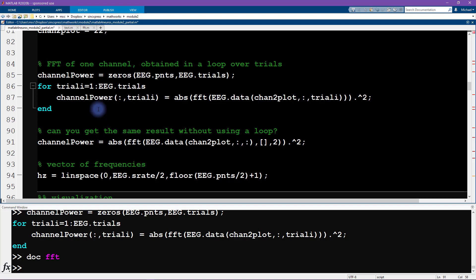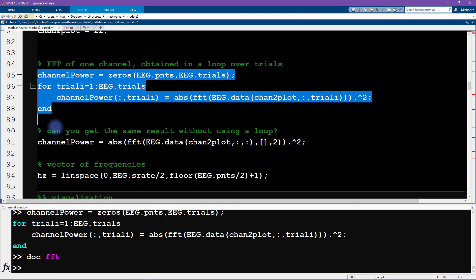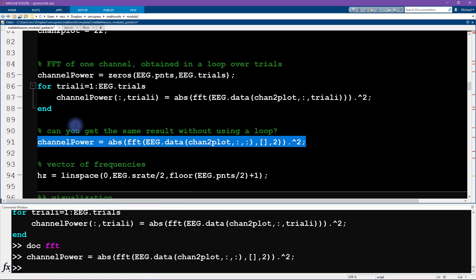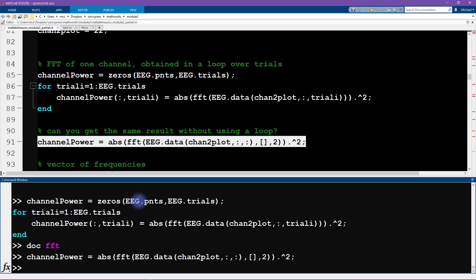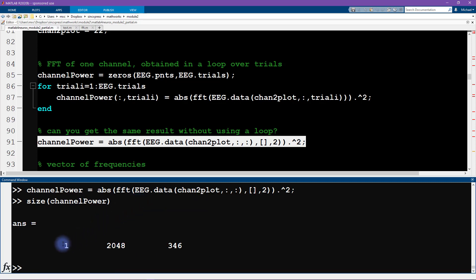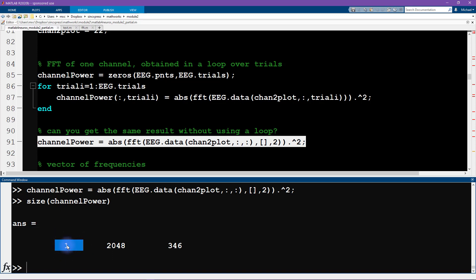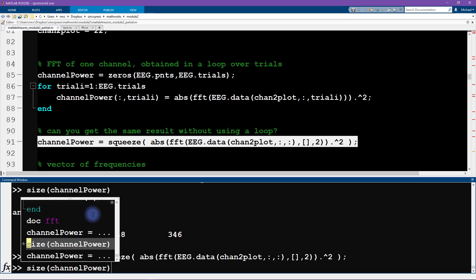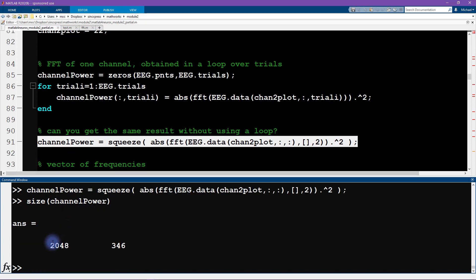Let's look at the size of this variable channel power. You can see it's actually still a three dimensional matrix, it is a one by 2000 by 346 matrix. This is called a singleton dimension, a dimension with only one element in it. This can cause some confusion later on in the code. I want to tell MATLAB to squeeze it down to get rid of this singleton dimension. The function we use is squeeze. Now we've lost the singleton dimension and this is just a two dimensional matrix.